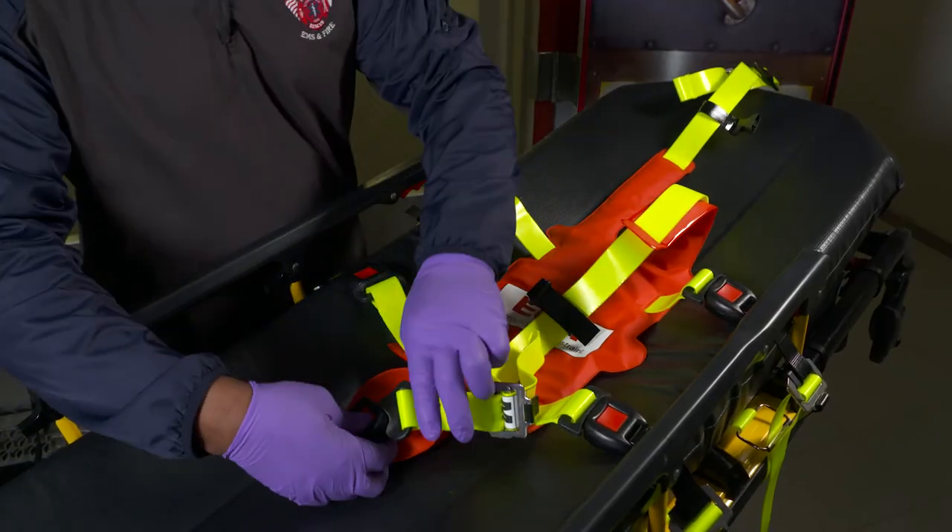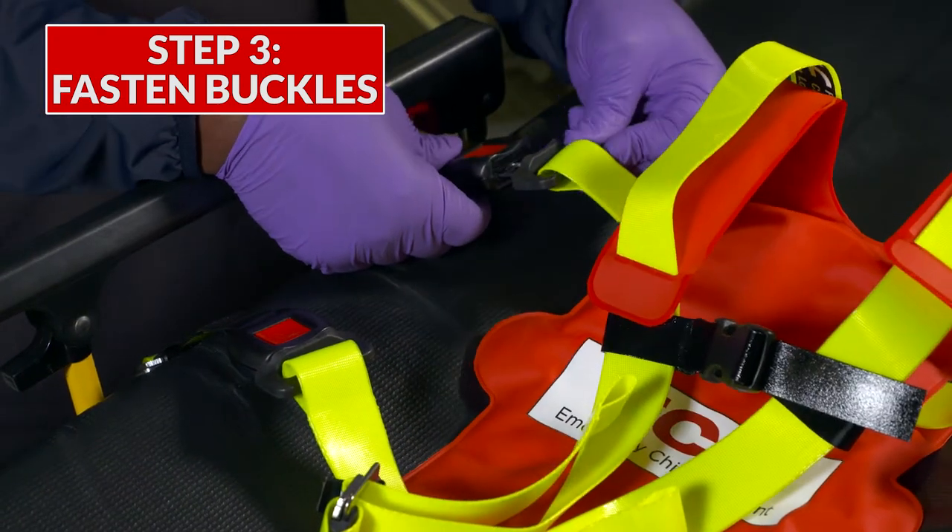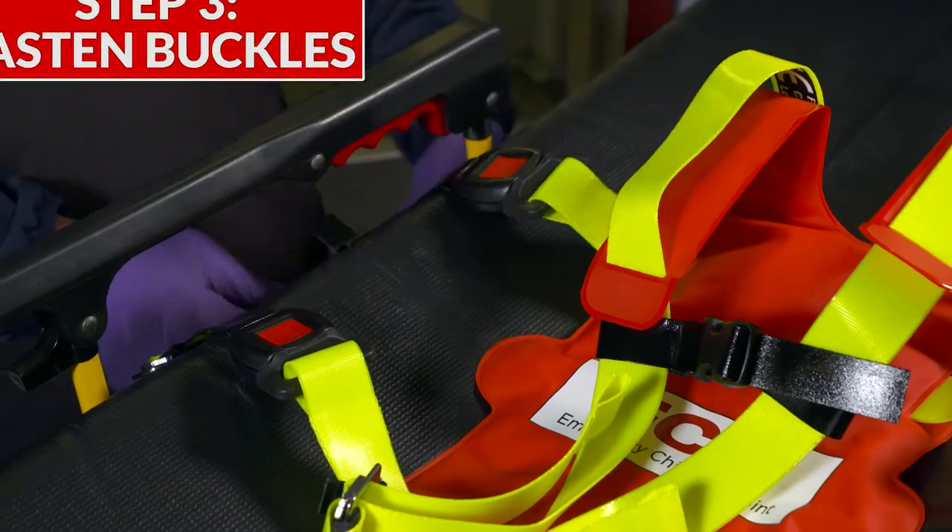Now extend all the straps. Using the four belt buckles that were previously attached to the cot frame in step one, click each one into place to the corresponding harness straps.